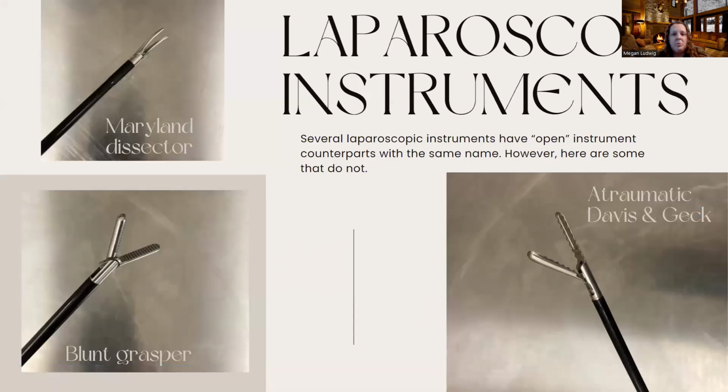All right, a couple instruments here, specifically laparoscopic, so abdomen. I just point out here that a lot of laparoscopic instruments have an open counterpart. So, for example, a Babcock. There is a laparoscopic version of a Babcock. I think of a couple others. You know, they're just going to look very similar. Now, these are some exceptions to the rule.